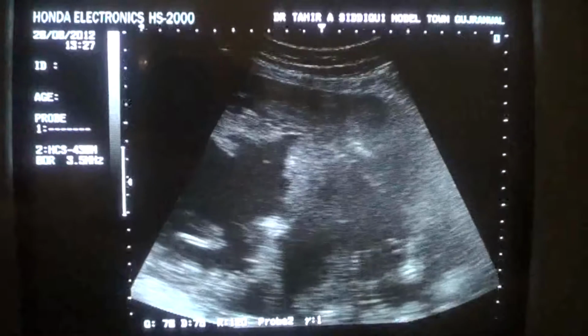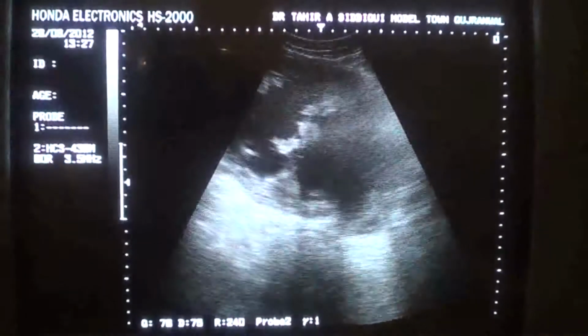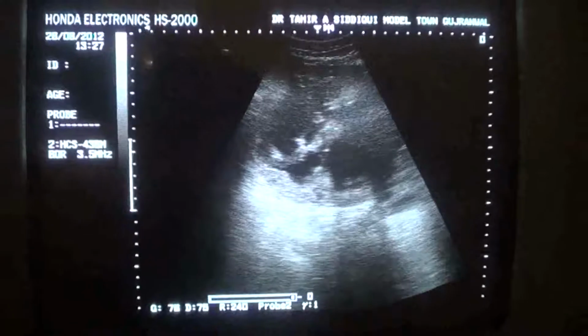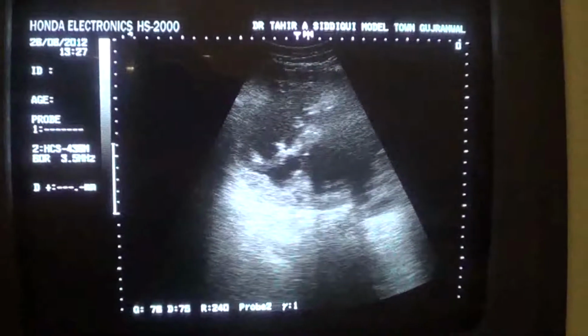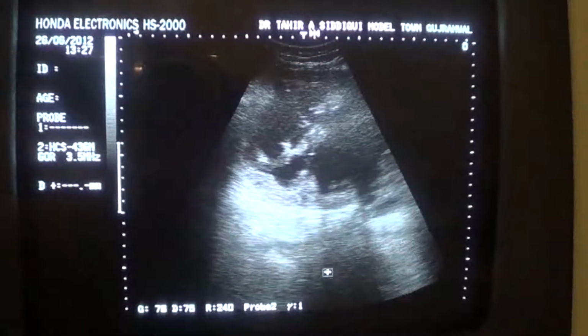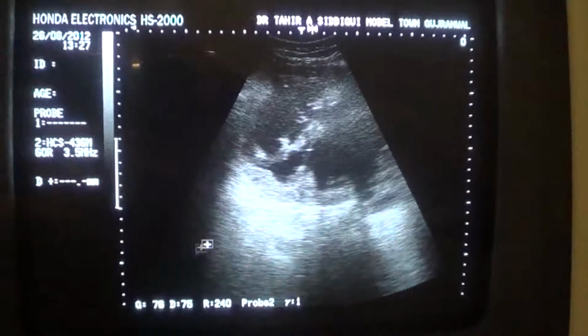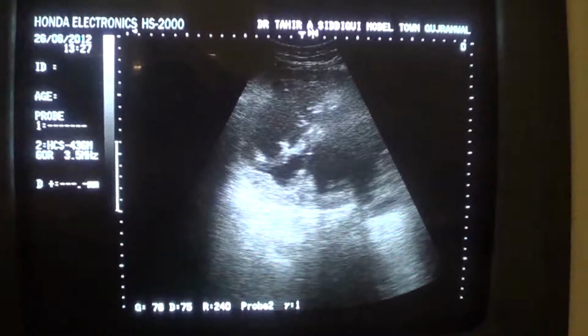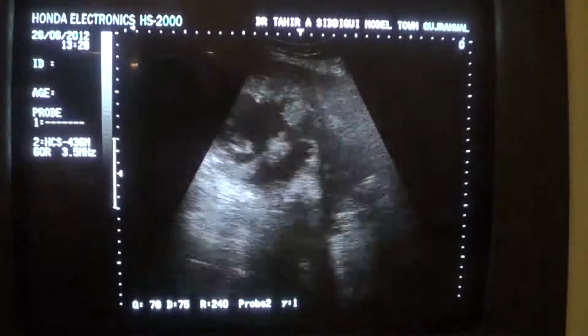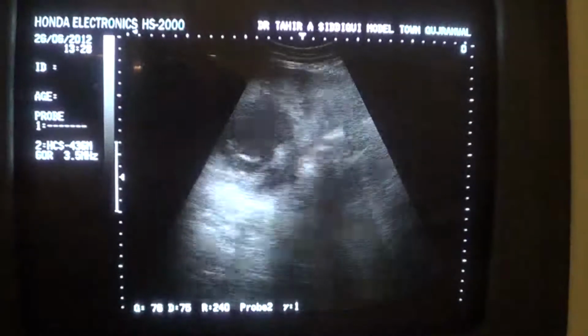Okay. Now, does this cyst give any posterior acoustic enhancement? It is in front of you. We see a dense echogenic area behind this. This is the acoustic enhancement, which again goes in favor of a cystic mass.